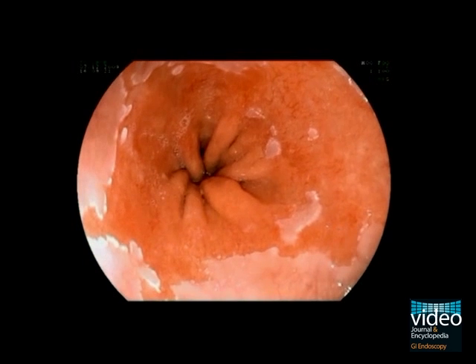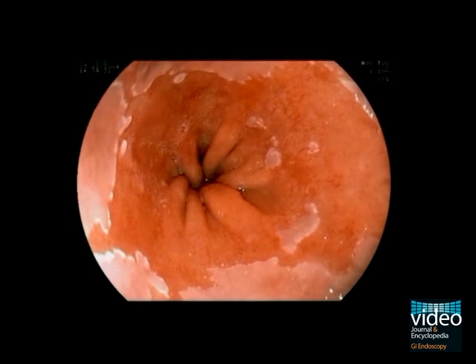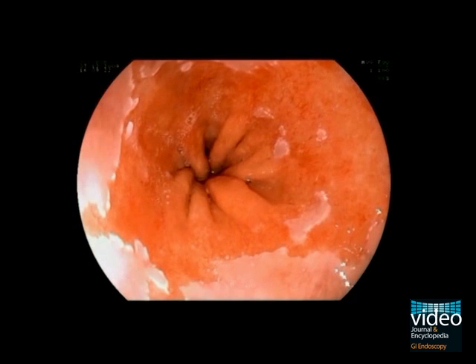Now you can see the whole dimension of the Barrett's esophagus. In the distal area, the esophagus wall is covered by metaplastic epithelium.